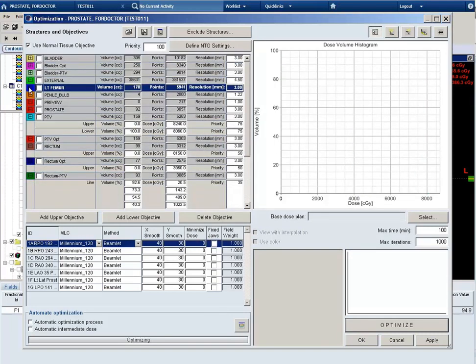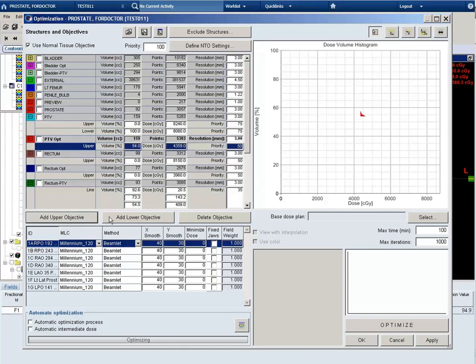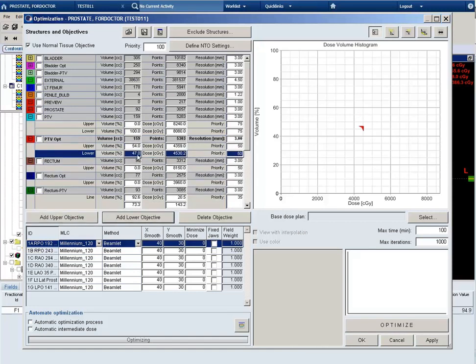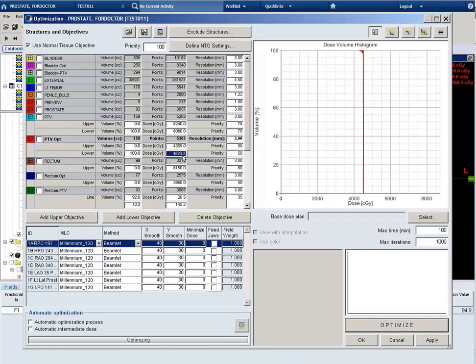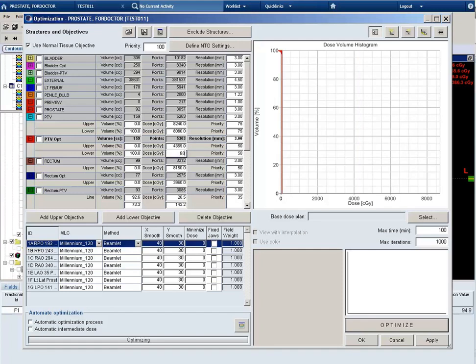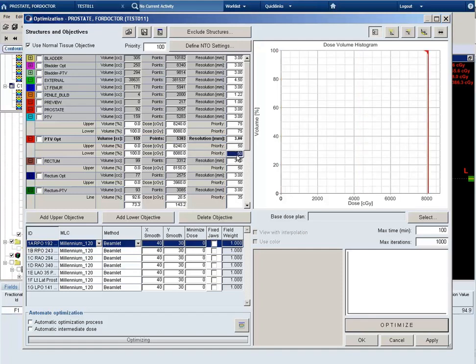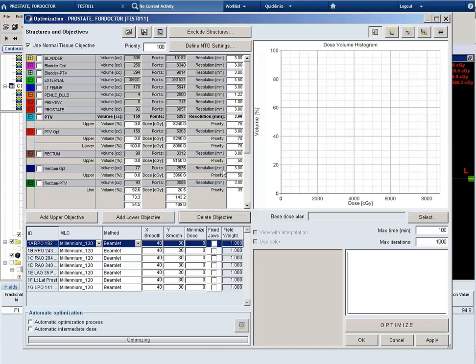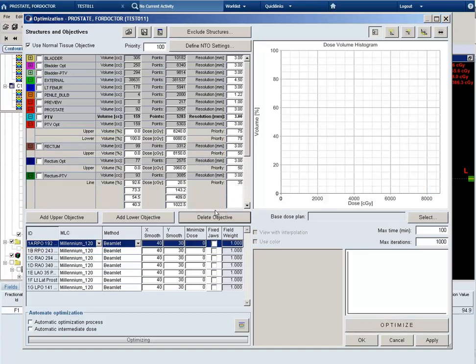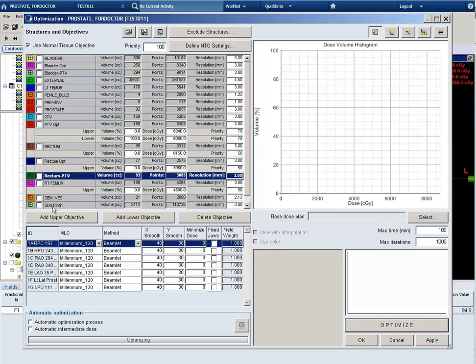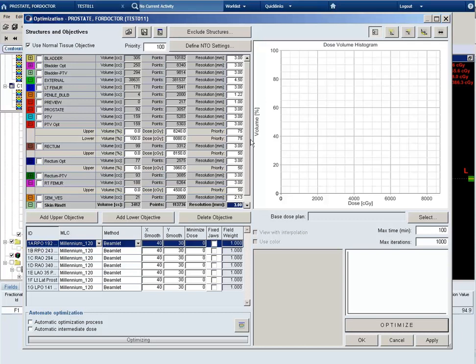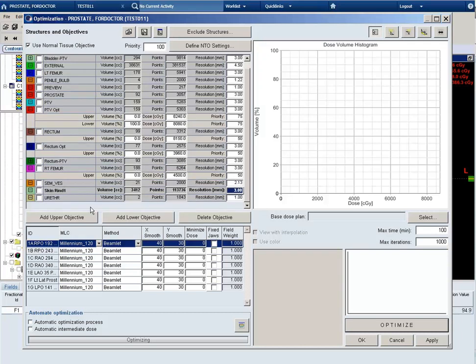So I'll create an upper and lower objective for the PTV opt. I'm just transferring the same dose constraints and priority from the PTV. I will then delete the PTV constraints. And this will help improve our coverage superiorly.